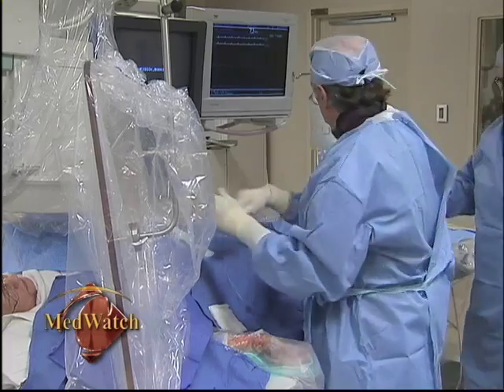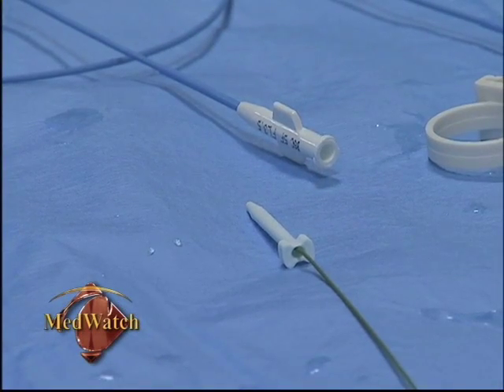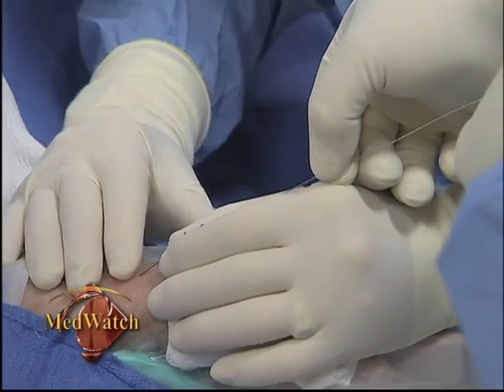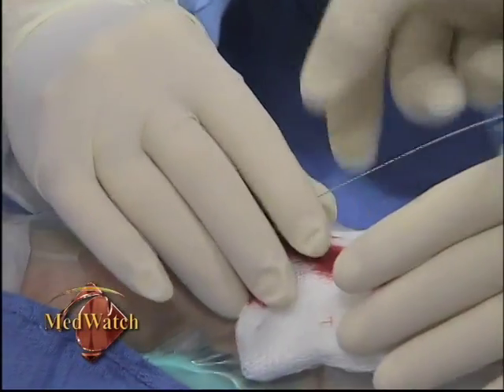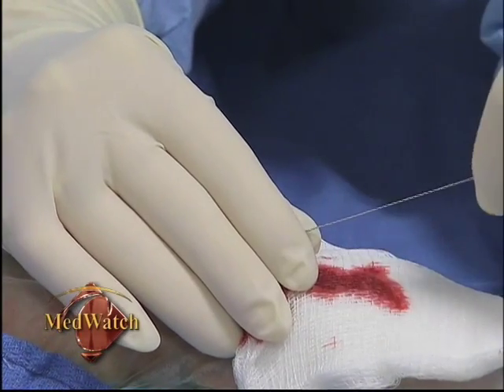Dr. John Ambrose is the director of cardiology at Community Regional Medical Center, where they are using an alternative entry point, the wrist area. Here, we make a puncture in the radial artery, which again is right behind the thumb. It's typically where maybe someone might feel a pulse. In the transradial, or wrist angiogram, the surgeon threads a wire and a catheter all the way up into the heart, where he can look for blockages or other problems. Terrific. So we're into the artery.